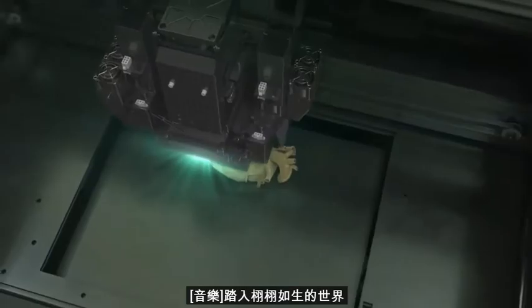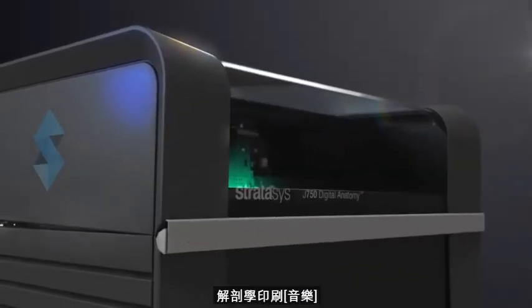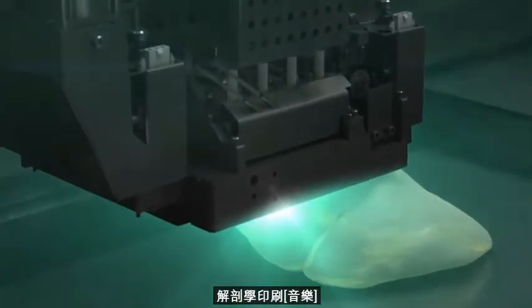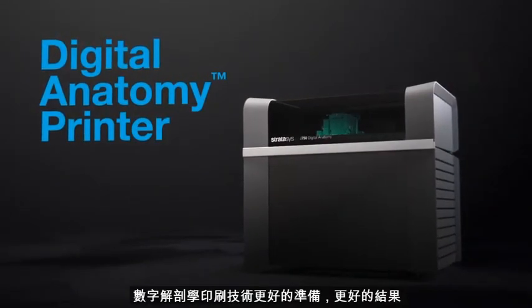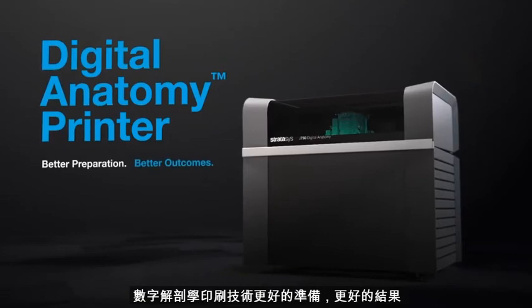Take a step into the world of lifelike anatomical printing. Digital anatomy printing technology. Better preparation, better outcomes.